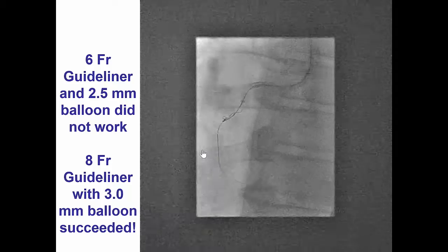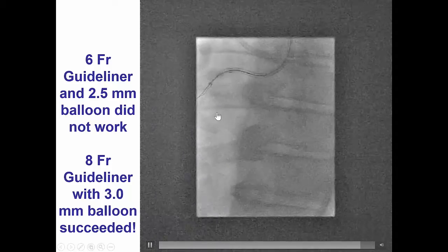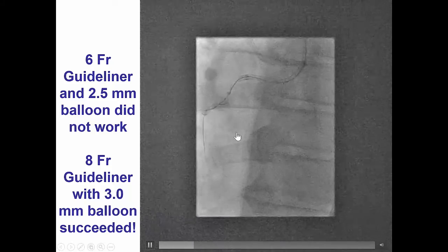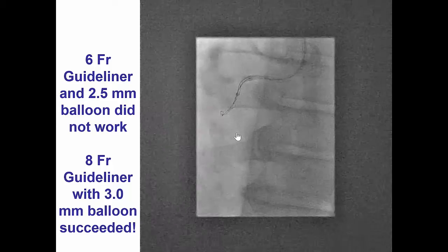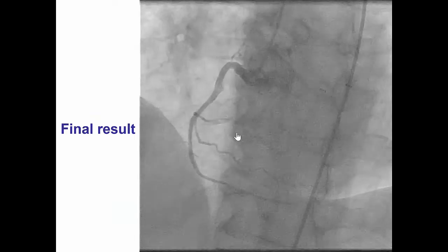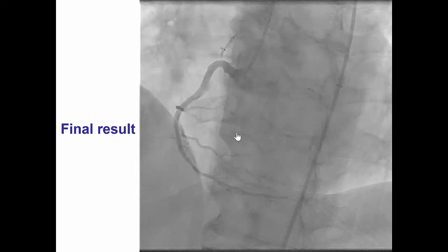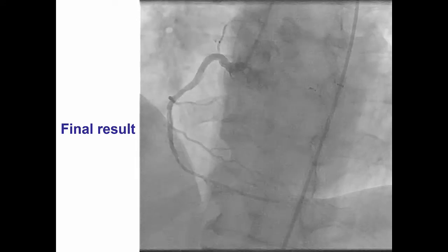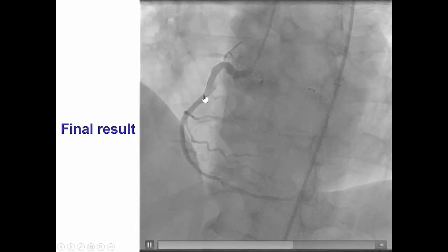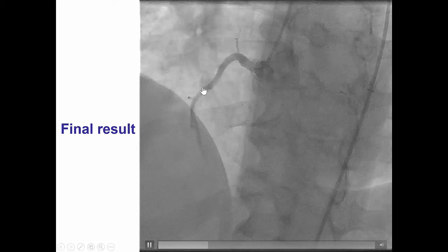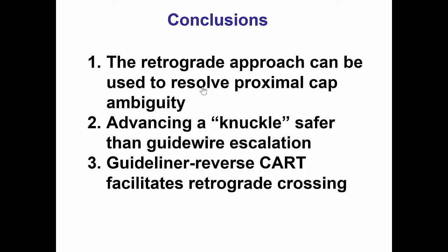Therefore, we upsized to a larger 8-French guideliner, which was advanced to the mid-right coronary. After dilation with a 3.0 mm balloon, we were able to advance the retrograde wire all the way to the antegrade guide. The wire was externalized, stents were placed, and we obtained a nice final angiographic result with TIMI-3 flow into the distal right coronary artery. There remains a small area of dissection outside the stents; however, there was excellent flow and no evidence of perforation.